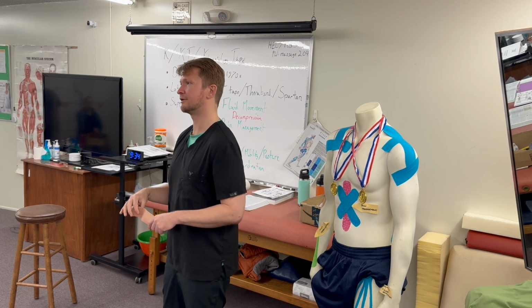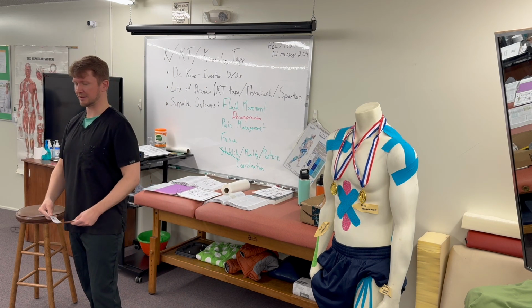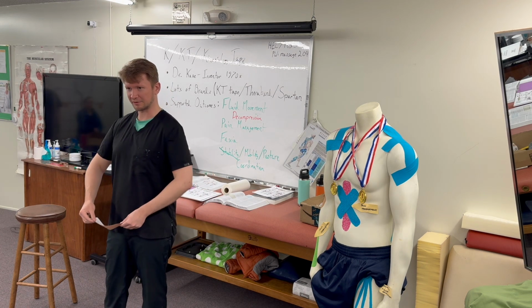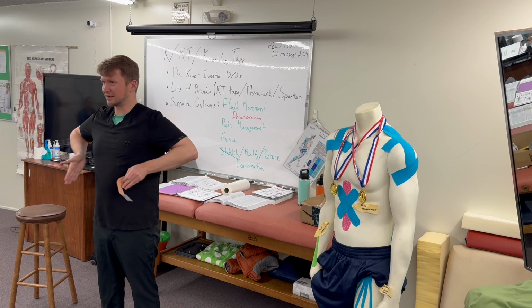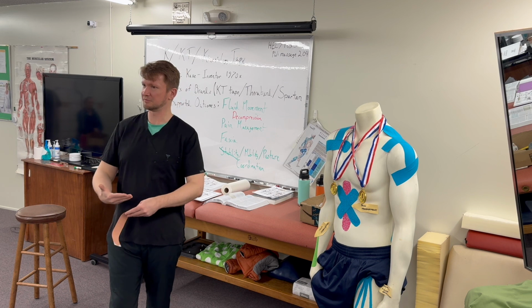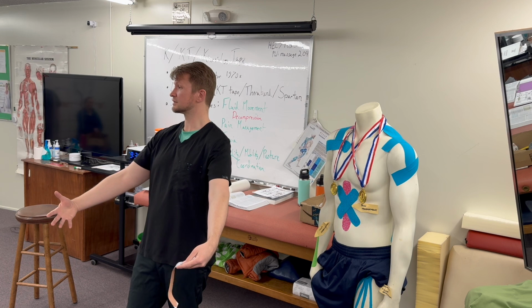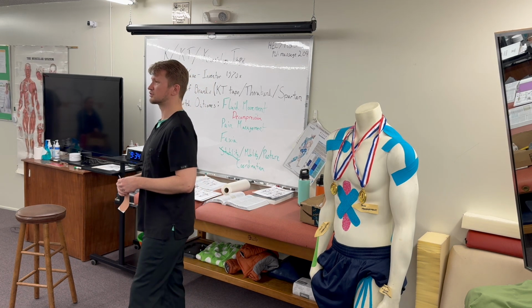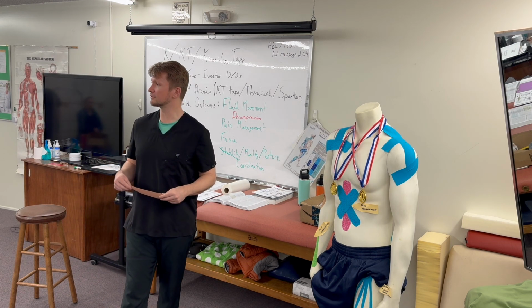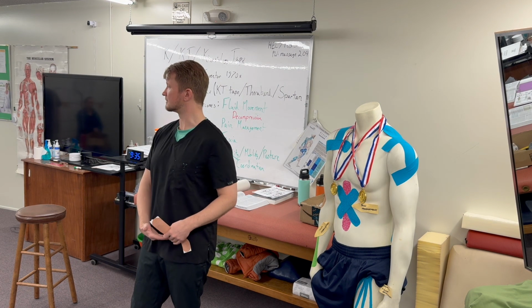Somebody had asked me about taping for pregnancy, and they will use a tape like this, and I'll try to show that process so that you have an awareness of it. The idea is you create a cradle. Here's the belly. I'm going to use a piece of tape to lift the belly and tape it up to the ribs to create some lift. But the skin here is already stretched, right? So when I tried it on Laura, my sister, she did like it. It felt good, but she had a tough time when she removed it, with that area being irritated.